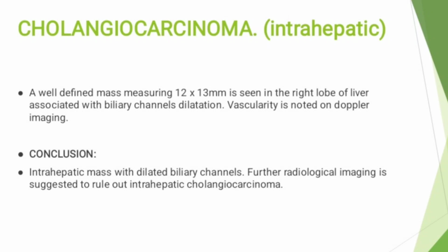Vascularity is noted on Doppler imaging. In the conclusion, intrahepatic mass with dilated biliary channels. Further radiological imaging is suggested to rule out intrahepatic cholangiocarcinoma.